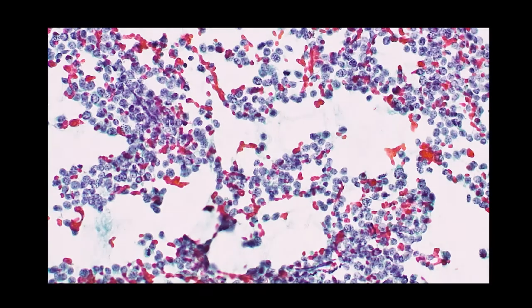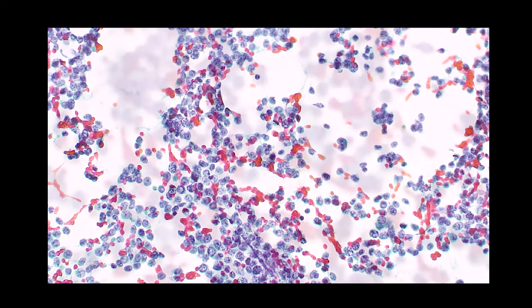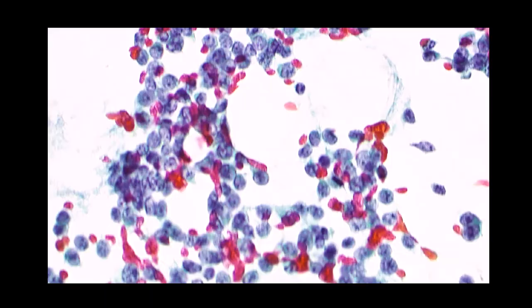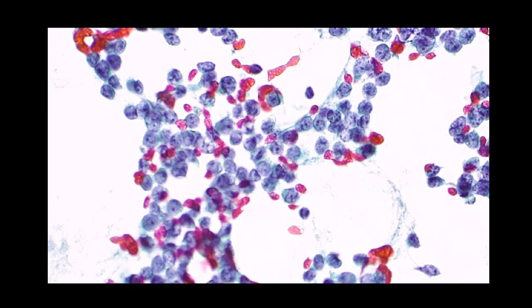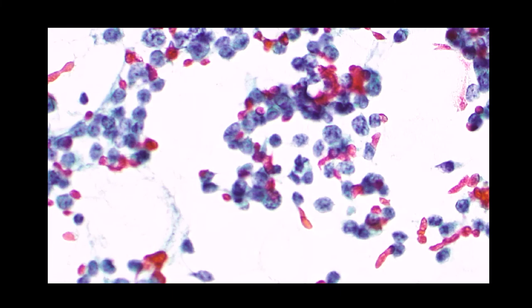This is a pap stain. You can see very little cytoplasm on this. It looks almost like bare nuclei, but in places I think you can see a little bit of fragile blue cytoplasm around the cells. But they're very tightly packed, as you can see, and forming again those linear arrangements of cells.